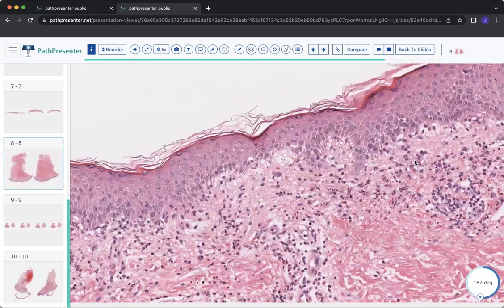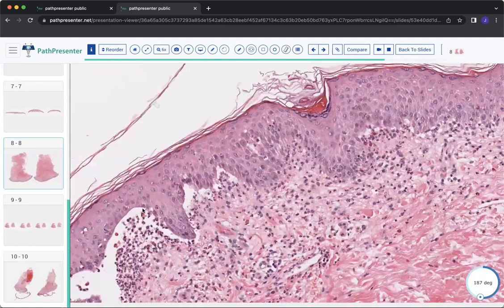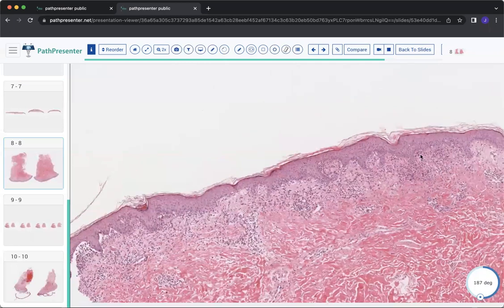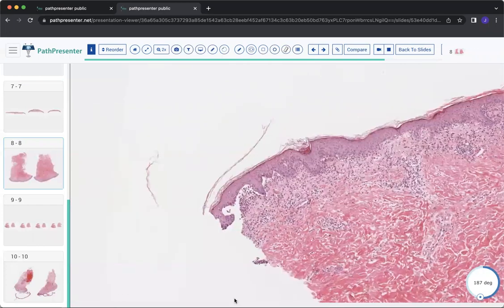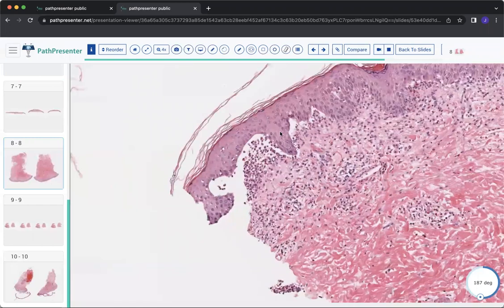And you can see that this is like a lesion that's just starting to form here, because as you go to the side, that's where you're getting a bulla. So they took the biopsy right on the edge of the blister, but they were really interested in this part here. And again, if you took a lesional biopsy very central to the bulla and this skin had been detached for quite some time, you're going to find a lot of reticular degeneration and cell death within this detached epithelium.